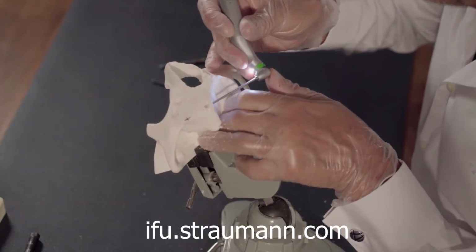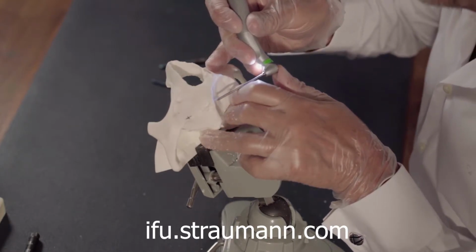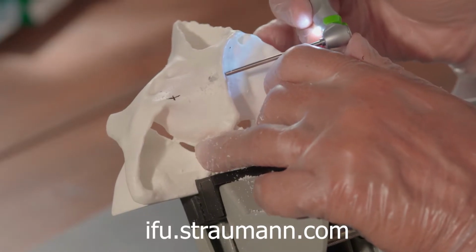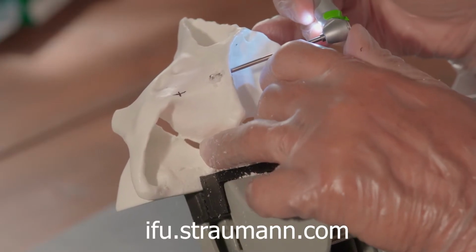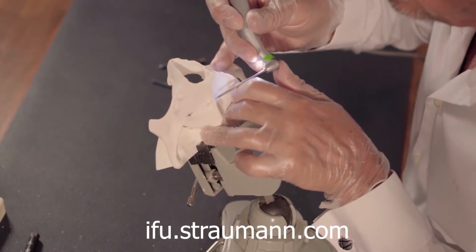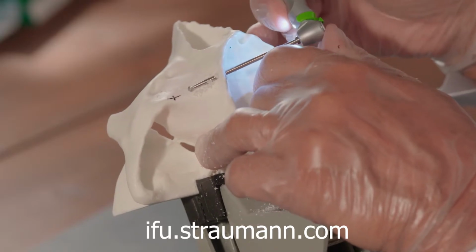We take special care not to drill into the sinus. In other words, we take special care to preserve the sinus lining and, if possible, to preserve some bone. You see, I'm drilling when I go back, not forward but back. Make a little bit more room. We shouldn't be in a hurry. It's going to be just one chance.